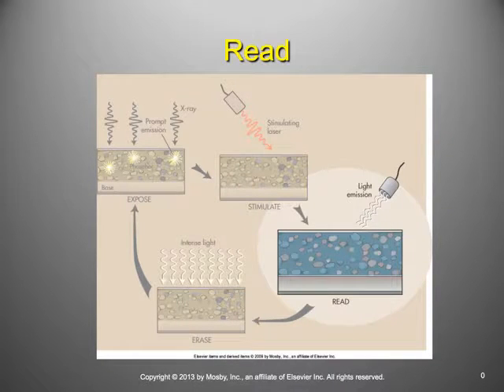has scanned over any of these europium atoms, the electron then returns to the europium and it emits light. It's going to emit a spectrum of light, and it's blue. I don't know if that's apparent in this illustration here, but the light that it's giving off is going to be a spectrum of blue.